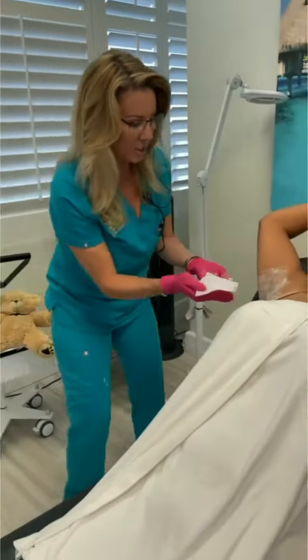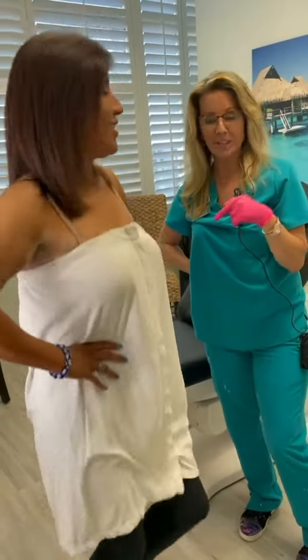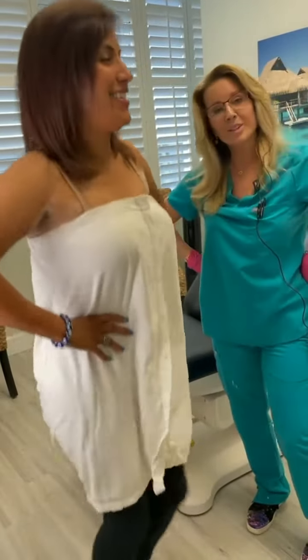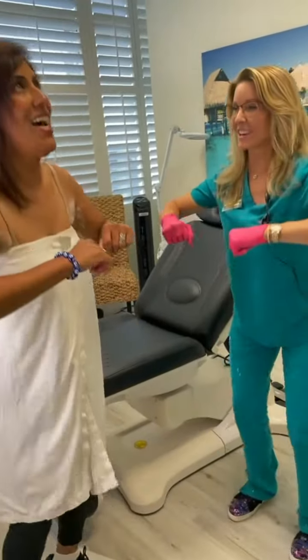I'm just going to let that sit and come back to see where she is. Since she's not sweating on her own, I'm making her jog in place so I can see how she sweats, because she is a sweater. I'm going to jog with her because we're both out of shape.